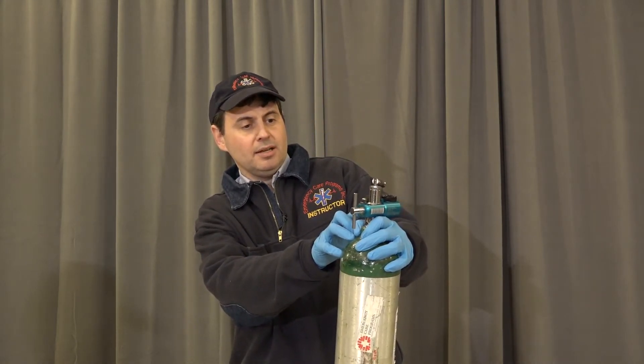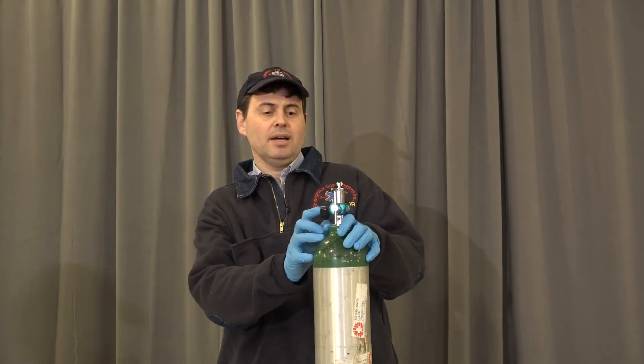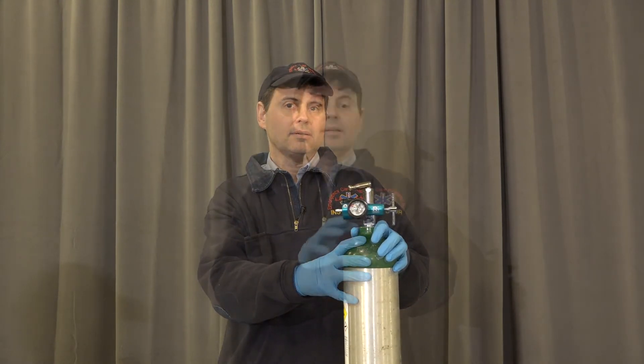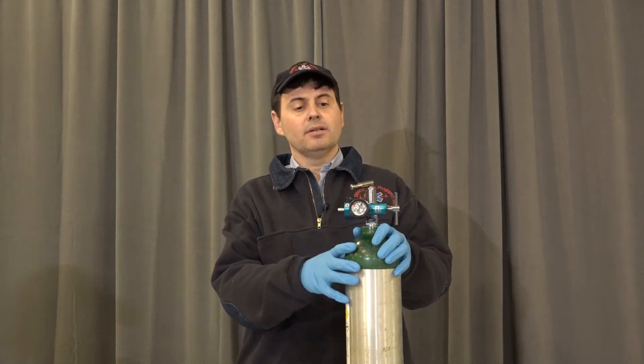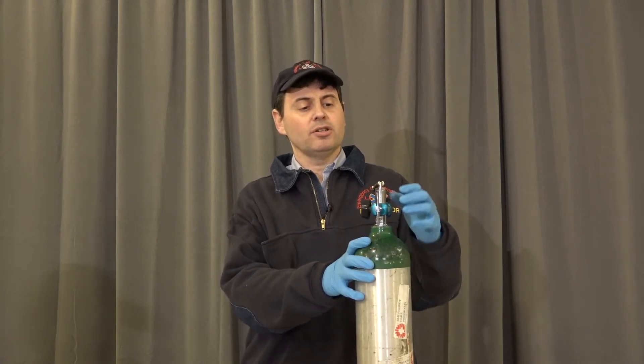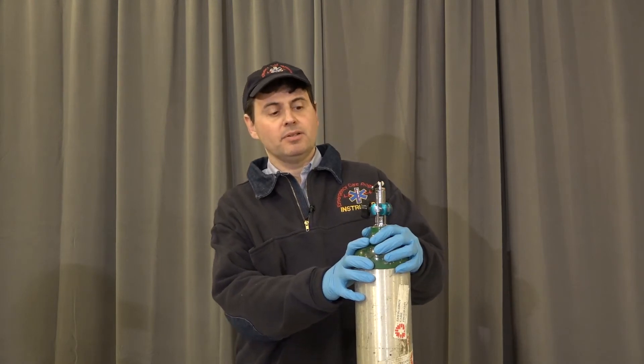We're going to read the pressure in the tank. This particular tank has 2,000 PSI. A full tank has 2,000 PSI and the safe residual pressure of the tank is 200 PSI. After we've read the pressure, we're also listening for any leaking of oxygen that may be coming out of the regulator, which might indicate a bad seal.